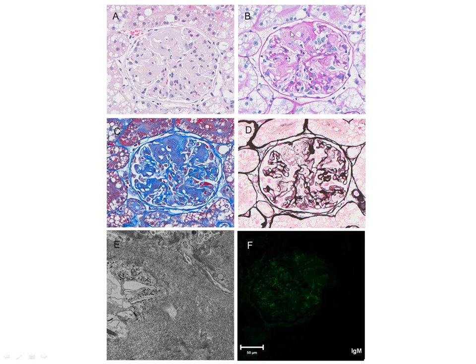I think that there's a synechia here. I think there is an adhesion between this region, although that could be the vascular pole, so maybe I'll take that back. Maybe there isn't a synechia. That might be the vascular pole. So I completely misspoke. I apologize.